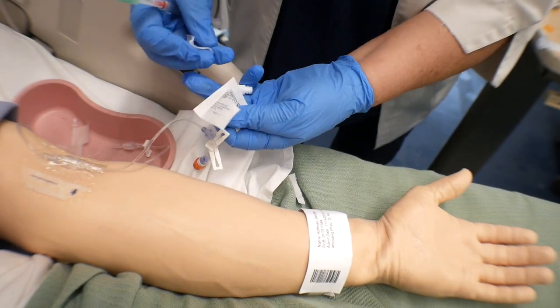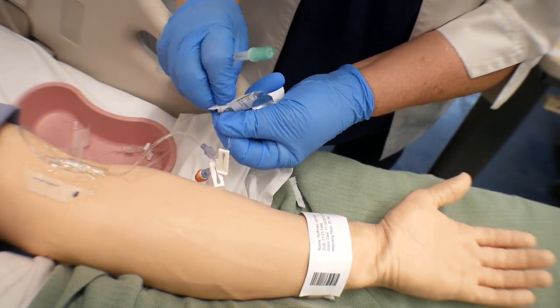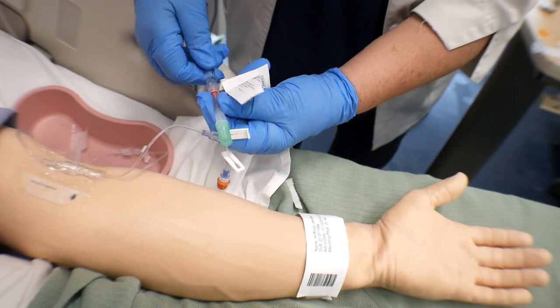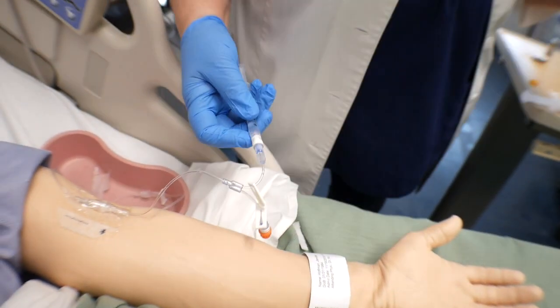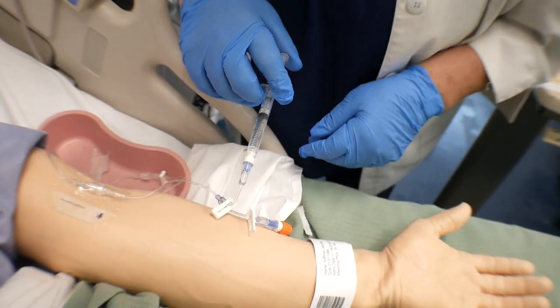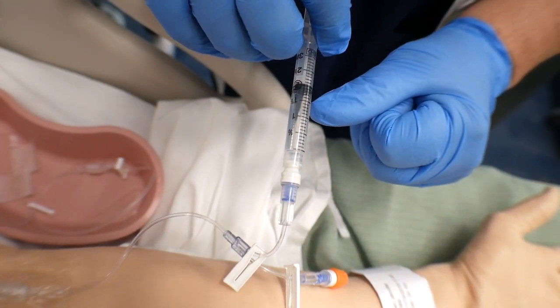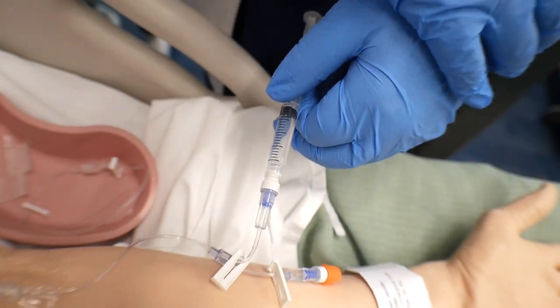So every time you connect, you need to clean again, even if you just took the other one off. We're trying to decrease sepsis. Okay, so my syringe, we already calculated that each 15 seconds I'm going to be pushing down to the half, here, here, and here for the whole minute.